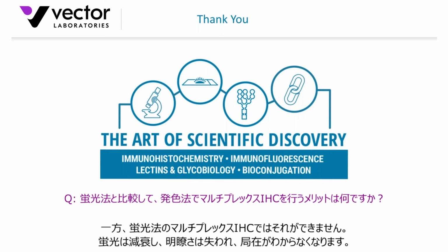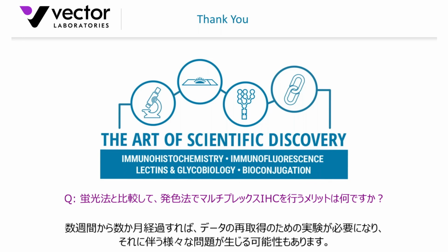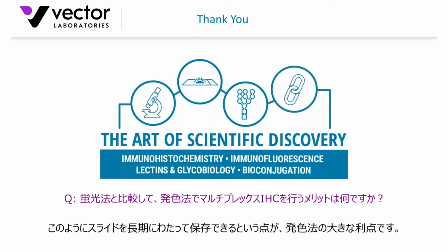It's dissipated from the site of localization. Potentially after weeks or months, you're going to have to repeat that result, and that might be problematic for a lot of reasons. So I would say that would be one certainly significant advantage of using chromogenic multiplexing over immunofluorescence.